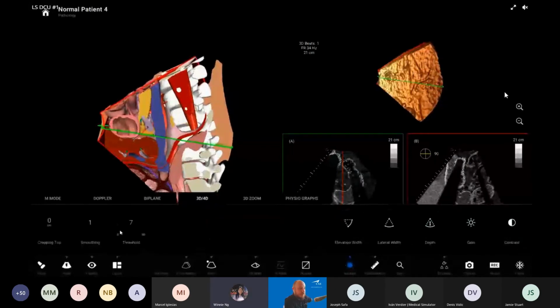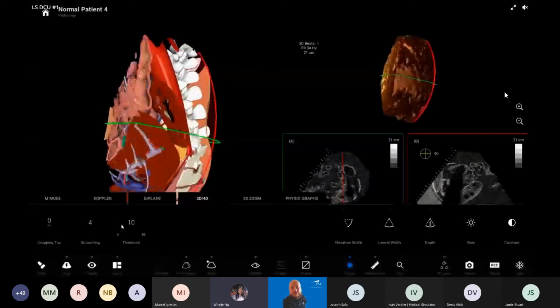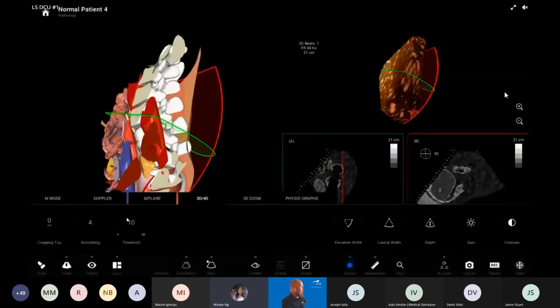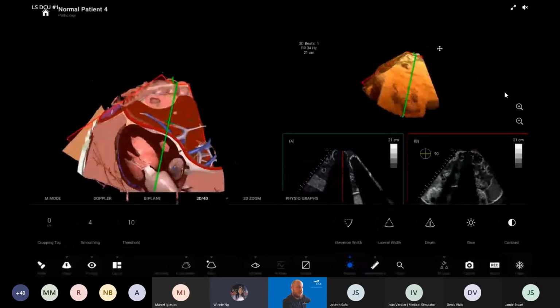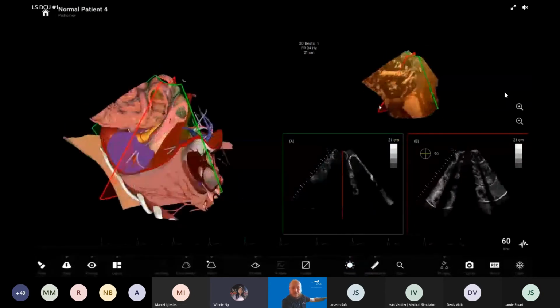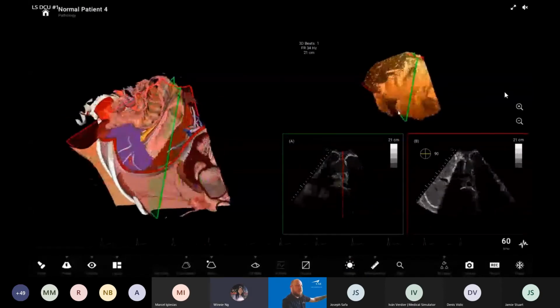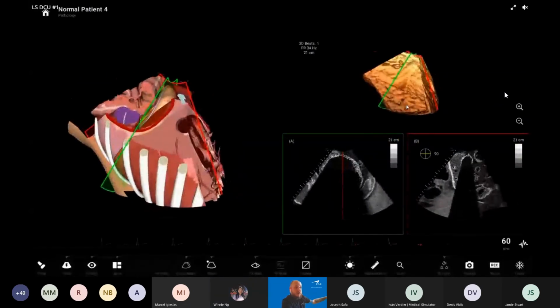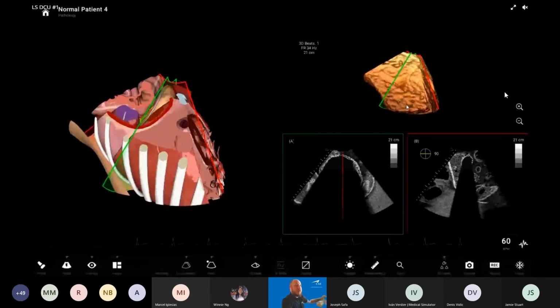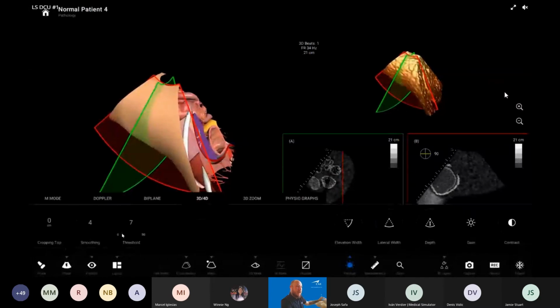Hi, Eric. If, let's say, you want to show 3D, 4D in abdominal, you could actually scan through the aorta. So let's say you want to do a demo with your customers, you could go to the aorta. Then you could actually play with the MPR to show the 3 dimensions of the aorta as well. Yeah, absolutely. Every structure, so very good point, Winnie. Thank you for this. Absolutely, all structures like aorta, like liver, like kidneys are available from here. So this is how it works.